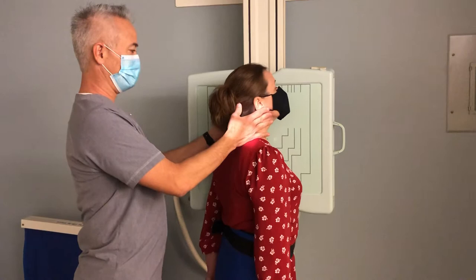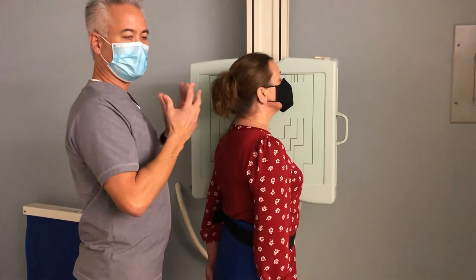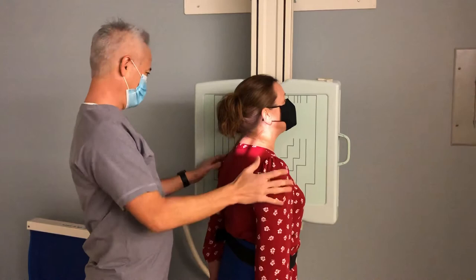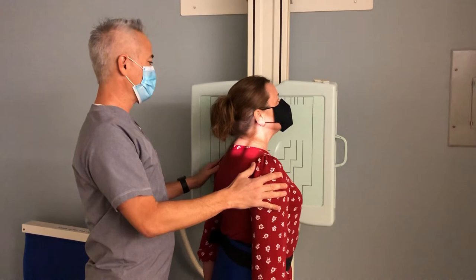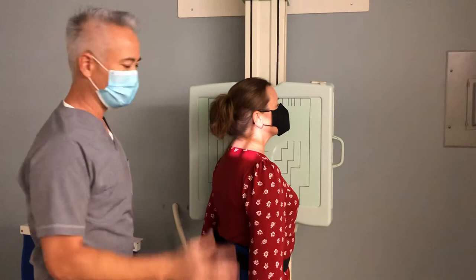Make sure you get the head in line with the body. Do not turn the head into a lateral position — keep it in line with the shoulders and the rest of the body. When you twist the neck, you end up closing the very top portion of the foramina, so that is the wrong approach. Keep that chin up, extending a little bit. Same breathing instructions as the lateral: take a breath in, blow it out, relax the arms, stop your breathing, don't breathe, don't move — then motor, exposure.